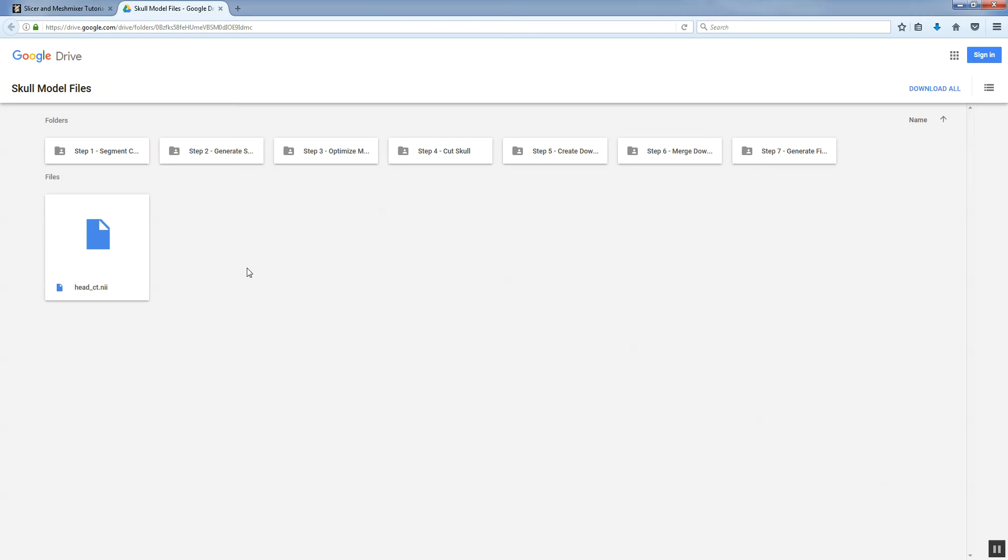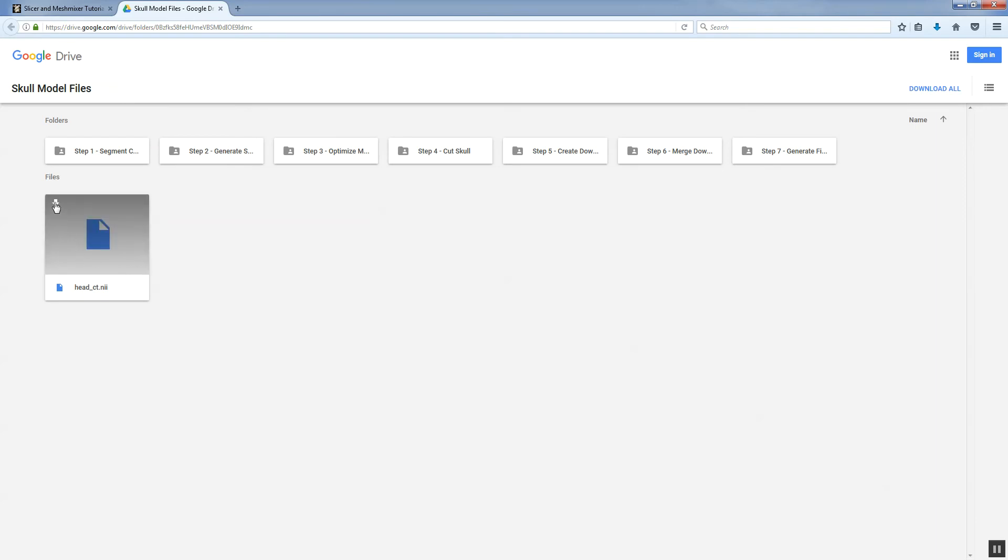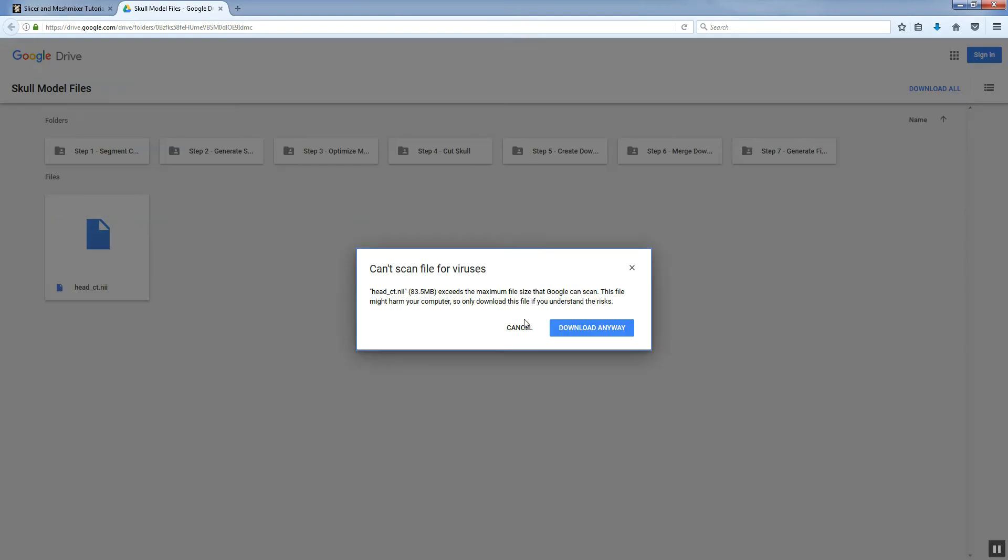That allows you to catch up and if you run into any snags, get an accurate version of the file and maybe see how it was done. It also allows me to take some shortcuts in the videos to speed things up a little bit. But the first step, we are going to segment the CT using Slicer and the first thing is to get our CT and that's the headct.nii file. So I'm going to download that.